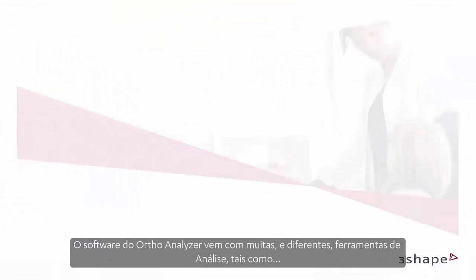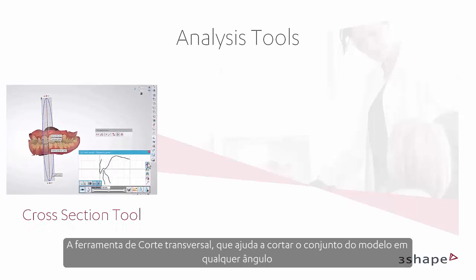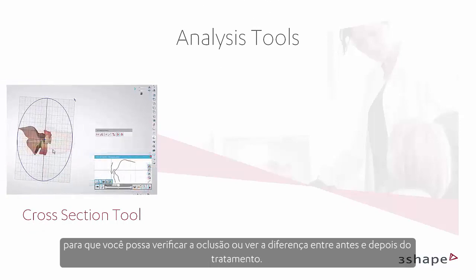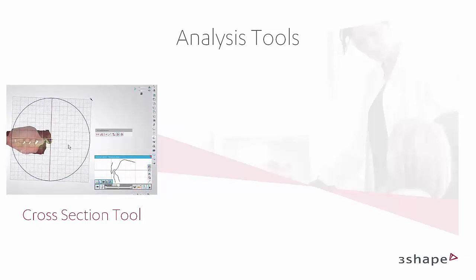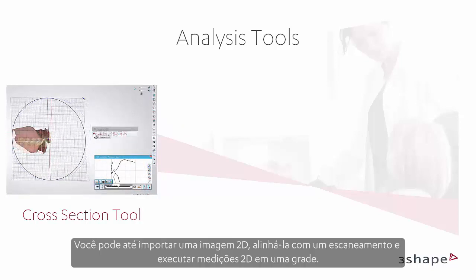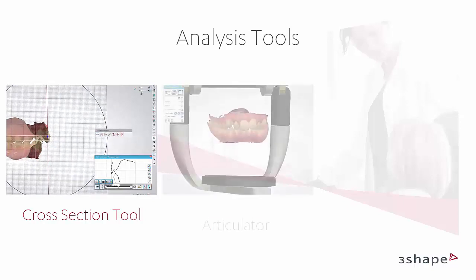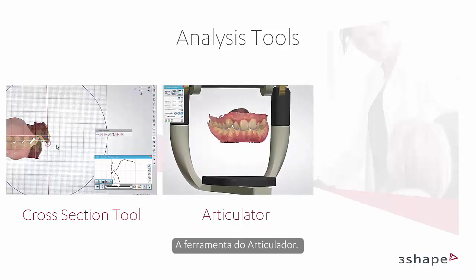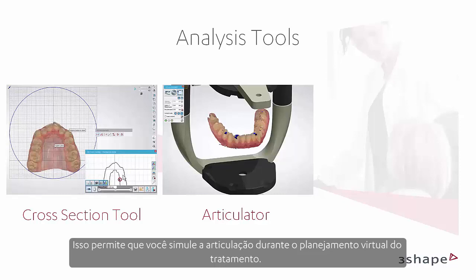The OrthoAnalyser software comes with many different analysis tools, such as the cross-section tool, which helps you cut the model set at any angle so that you are able to check the occlusion or see the difference between before and after treatment. You can even import a 2D picture, align it with a scan and perform 2D measurements on a grid. The Articulator tool enables you to simulate articulation during your virtual treatment planning.